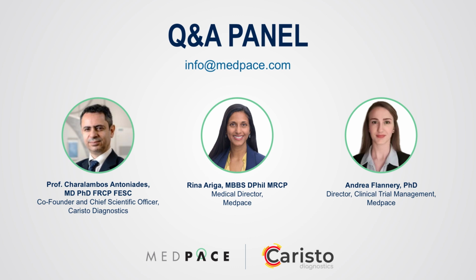Yeah, sure. So I think this is a very important point that CRO needs to always keep in mind. And when you organize these trials, you need to be very careful in keeping consistency. At the site level, it's important always for the scans to be performed with the same equipment, same setting at baseline and at the follow-up. This is partly mitigated, however, at the level of the core lab by the use of robust, regulatory cleared medical devices to analyze the scans, because these devices absorb most of the variability that may come up during the trial, coming from acquisition settings, particular local practices, and so on.